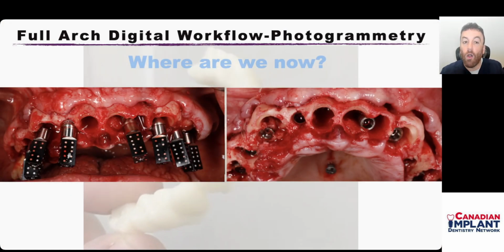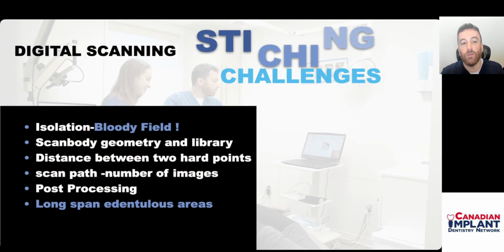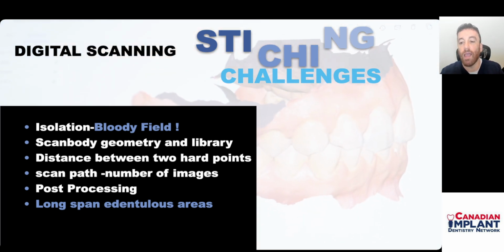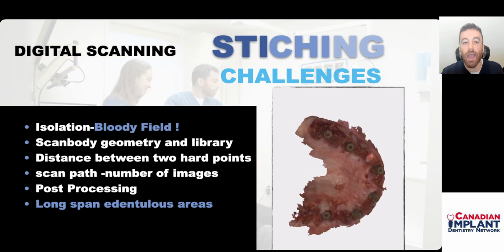So for full arch, where are we now in terms of digital workflow? We're relying on capture of the data on the day of the surgery and 3D printing on the same day as the surgery. For us though, I don't think that digital scanning alone is sufficient in order to capture that data. You have stitching challenges in terms of data capture.